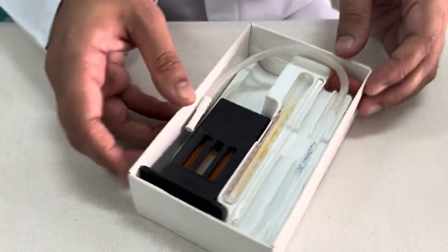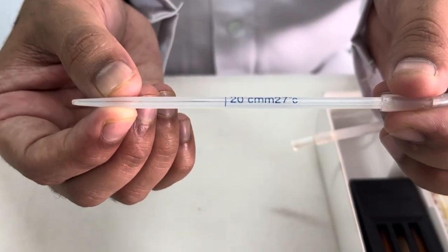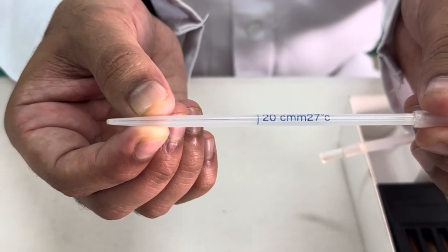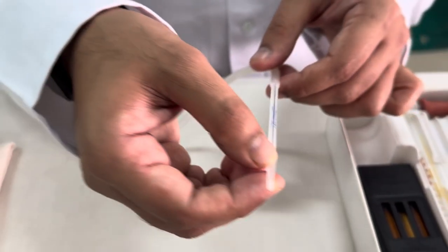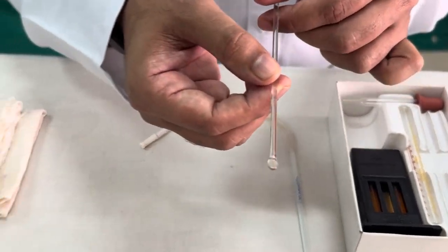So one by one we will see. First and foremost is the hemoglobin pipette. This hemoglobin pipette, you can see there is a marking 20 cubic millimeter or it will be 20 microliters. Few of the pipettes, few companies, it will show 20 microliters.